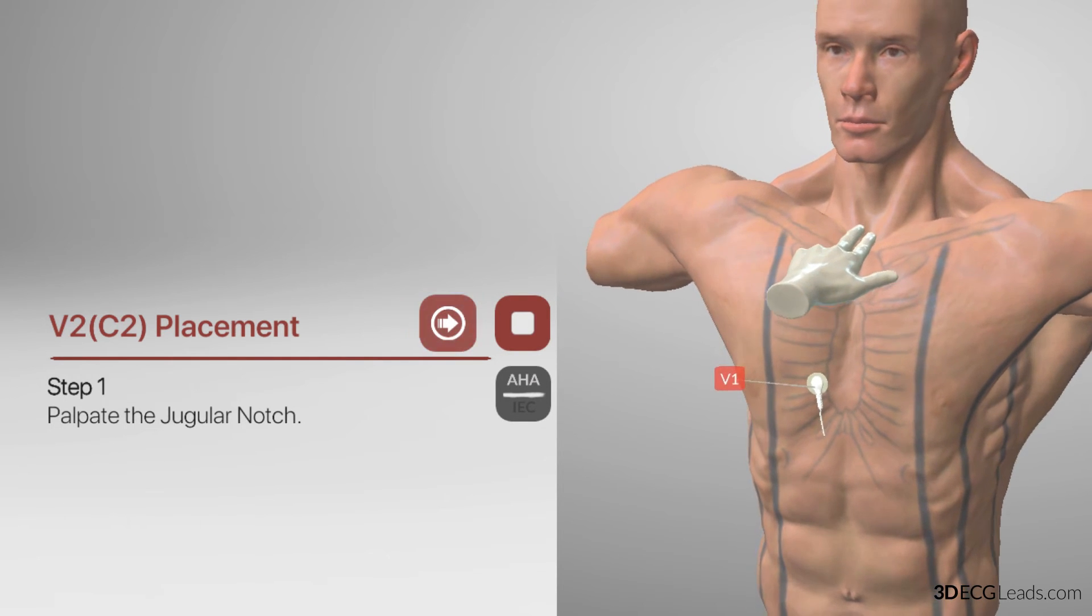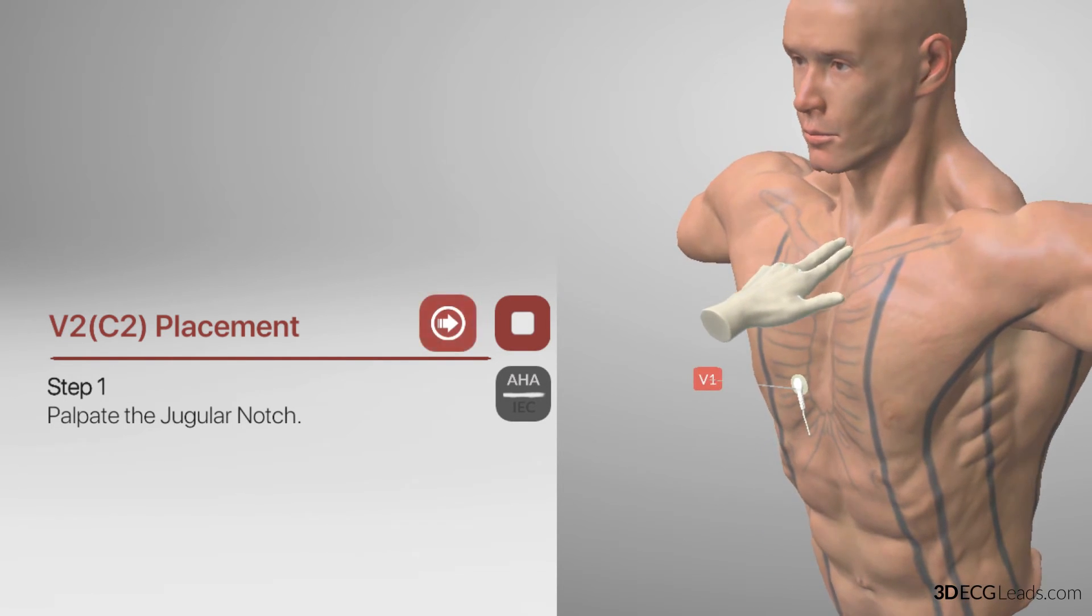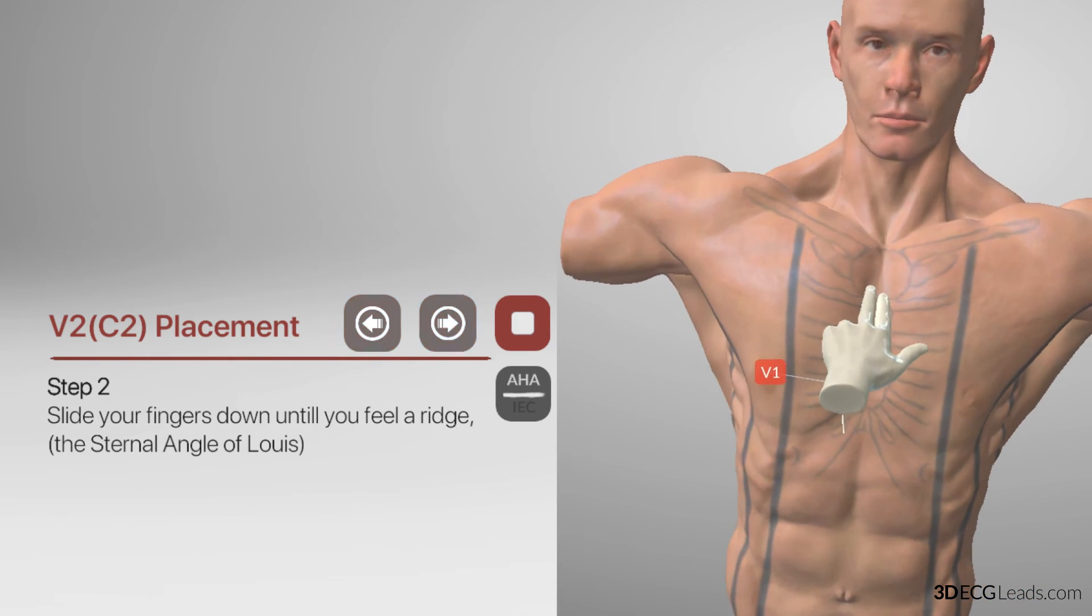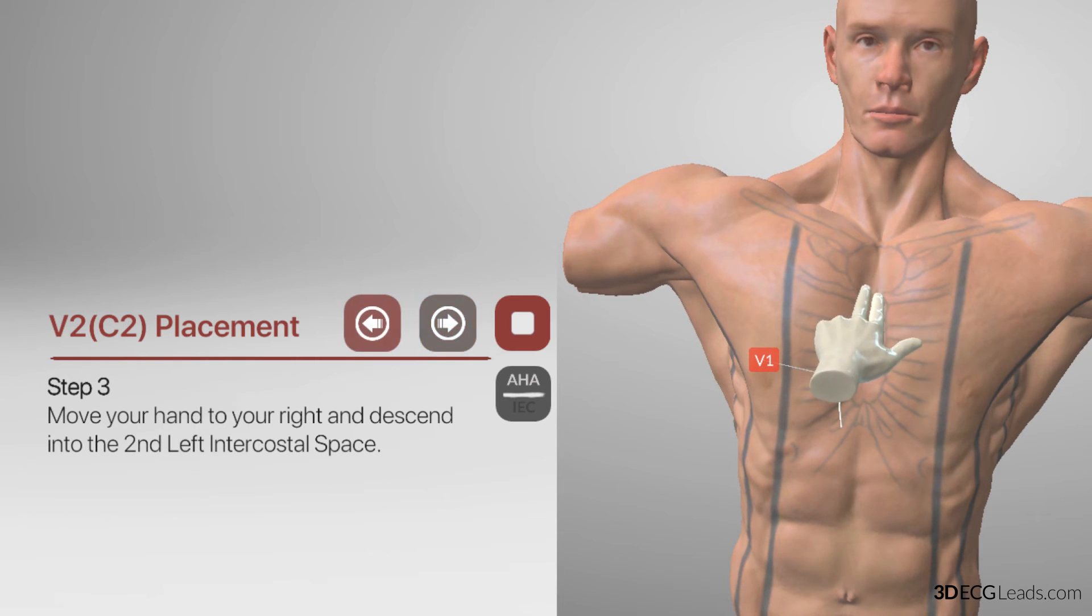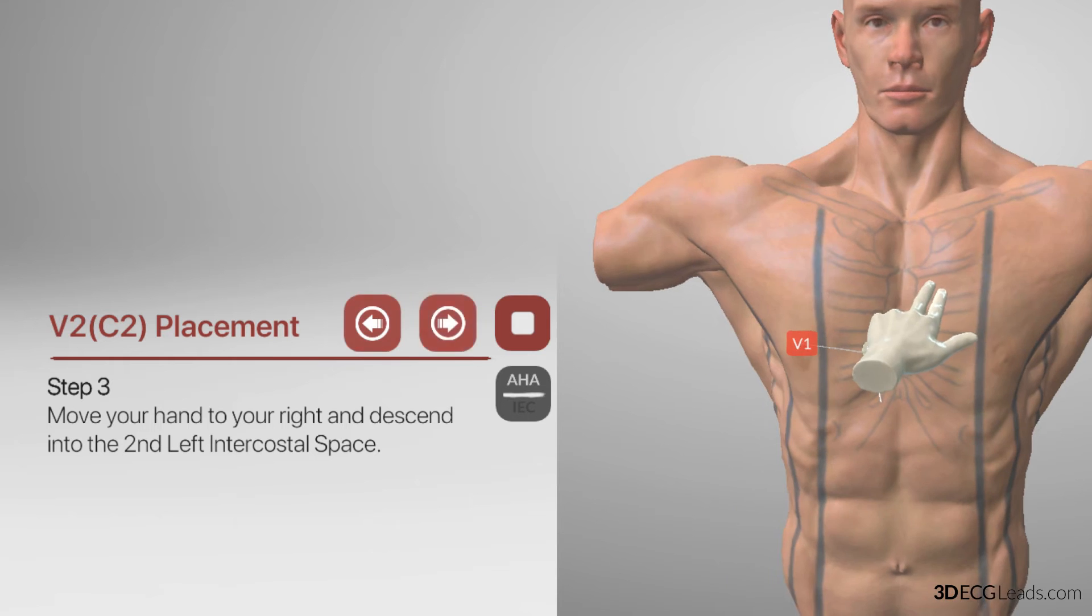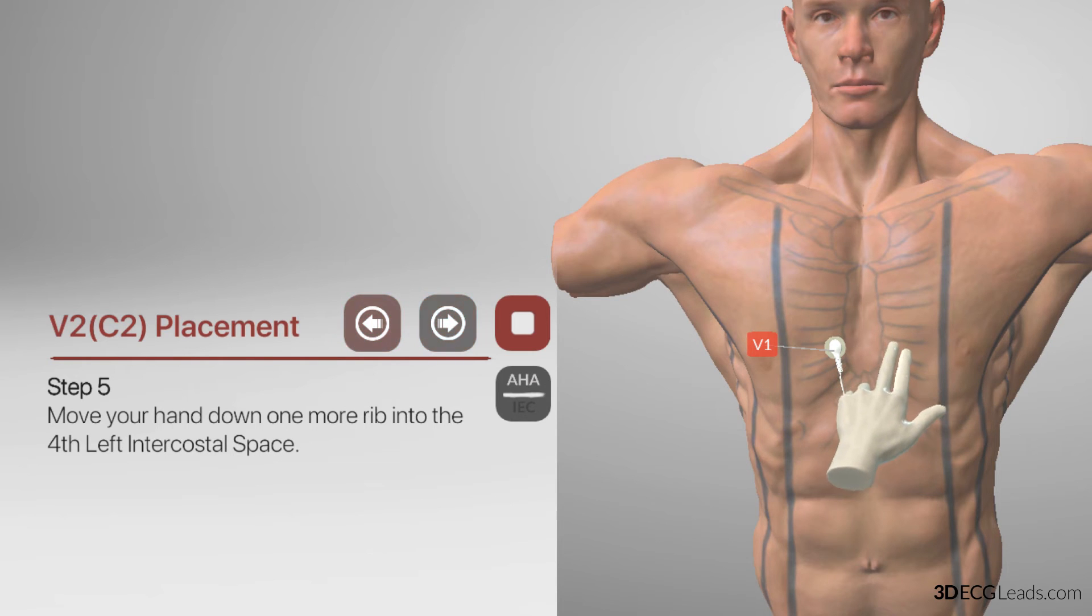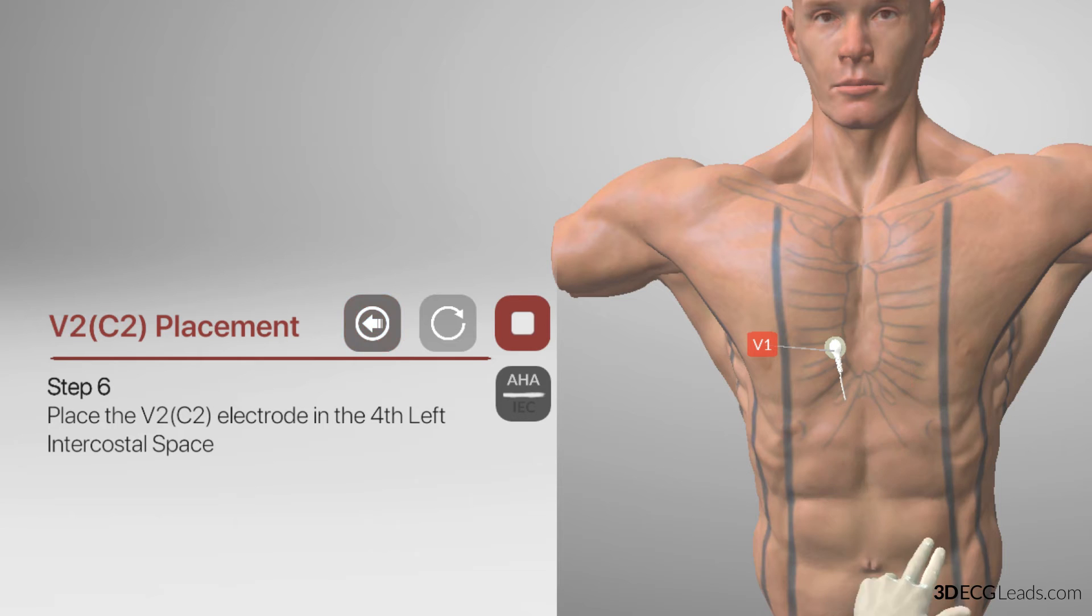So, after identifying the jugular notch, slide your fingers down to the sternal angle of Louis, in the same way we did for V1. But from here, move your hand to the right and slightly downwards into the second left intercostal space. And again, move your hands down another rib into the third left intercostal space, and now move your hand down one more rib. We are now in the fourth left intercostal space. Place the V2 electrode in the fourth left intercostal space on the left border of the sternum.